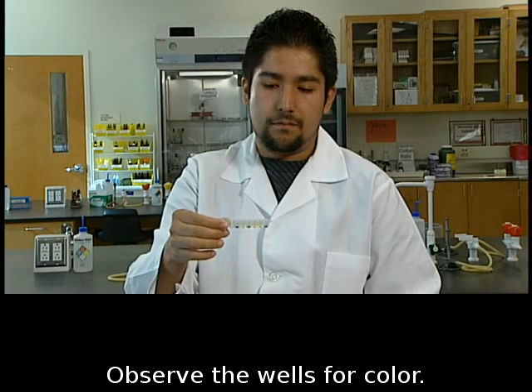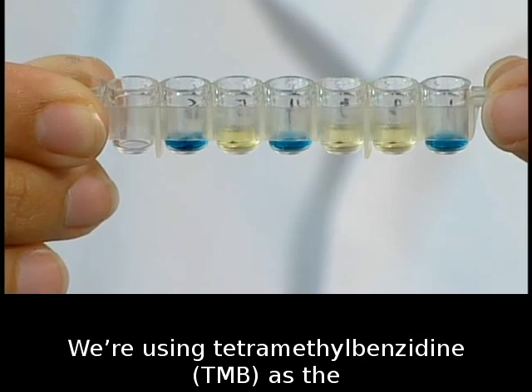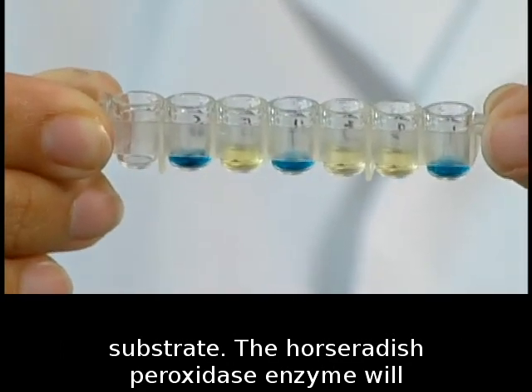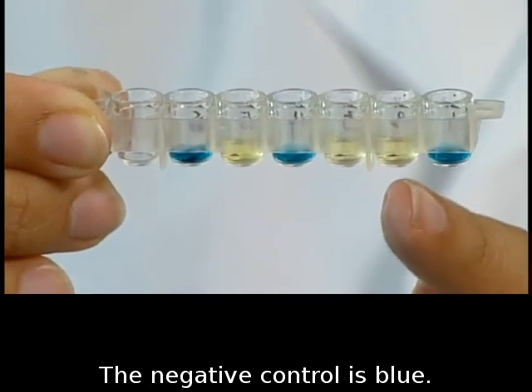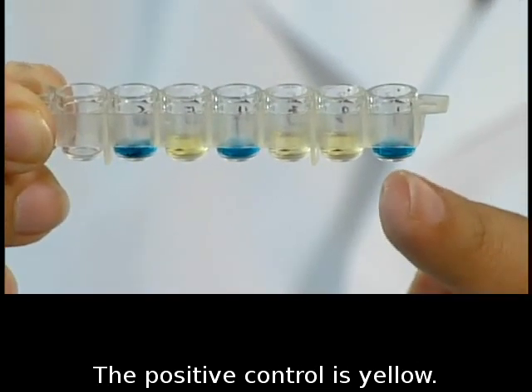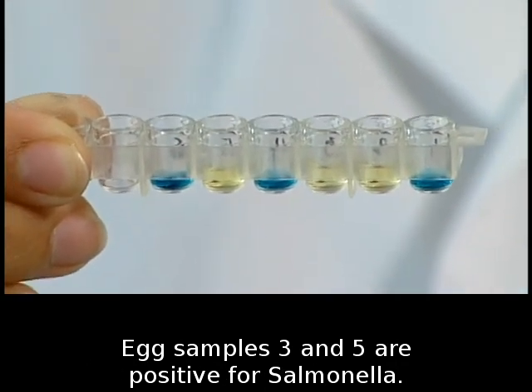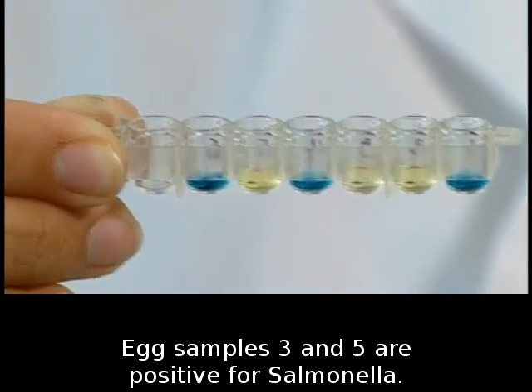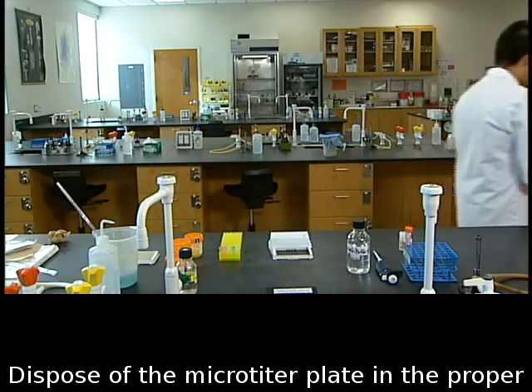Observe the wells for color. We're using tetramethylbenzidine, TMB, as the substrate. The horseradish peroxidase enzyme will make a yellow compound from the TMB. The negative control is blue. The positive control is yellow. Egg samples 3 and 5 are positive for salmonella. Dispose of the microtiter plate in the proper disposal area.